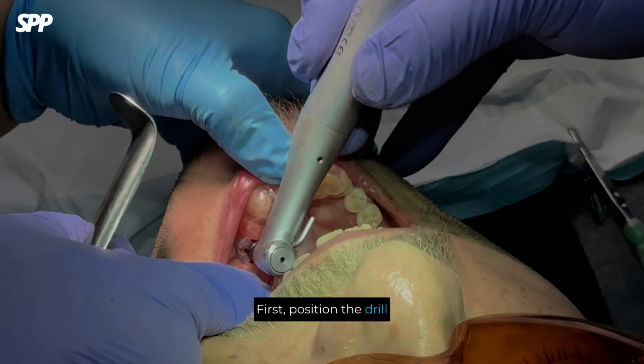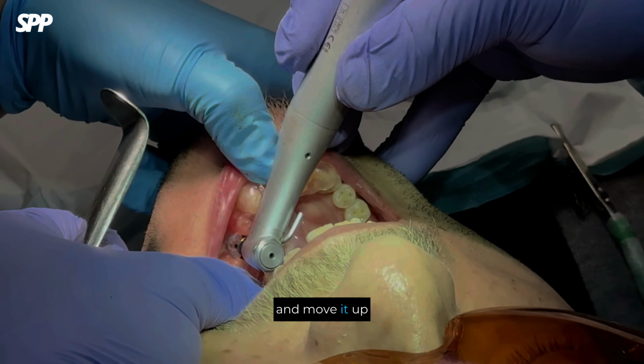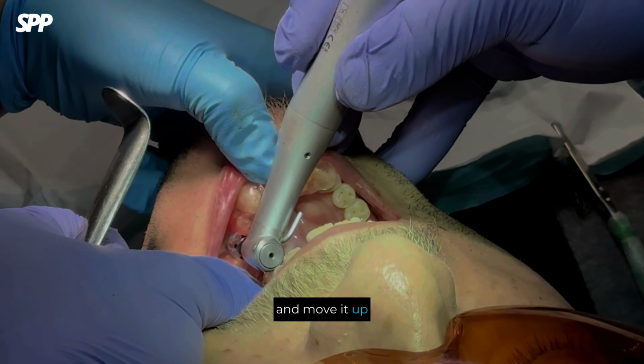First, position the drill inside the hole. Then, start the rotation and move it up and down. This is important for stable and safe drilling. I took the MegaGen Blue Diamond implant out of the package. One of the key features of the MegaGen Blue Diamond implant is the X-bead treated surface. This treatment gives the implant its distinctive blue color.